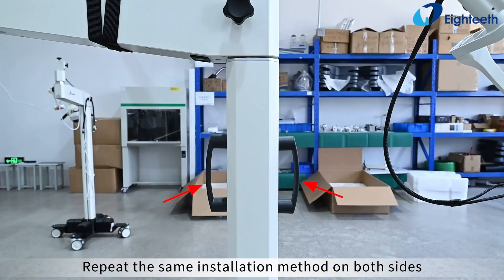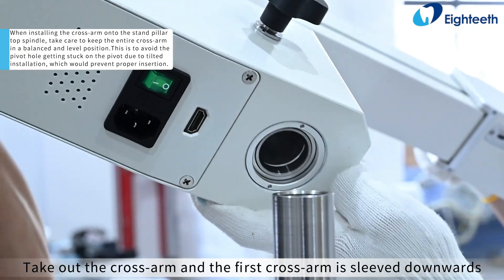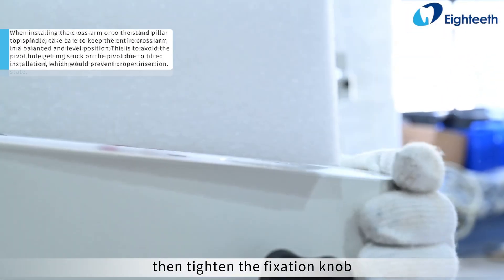Repeat the same installation method on both sides. Take out the cross arm — the first cross arm is sleeved downwards on the stand pillar rotating shaft until the end, then tighten the fixation knob.